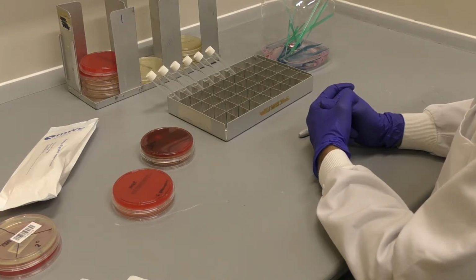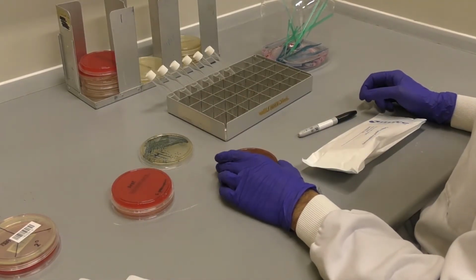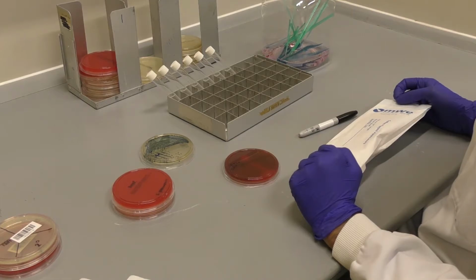The process is basically identical to that you'll undertake to set up an antibiotic resistance test. You need to label a suspension tube with the specimen number and isolate ID for each isolate to be tested, as well as one for the control strain. This will be ATCC 49619 for Streptococcus pneumoniae, or for E. coli ATCC 25922. Make sure your suspensions of test and control isolates are from fresh overnight growth on non-selective medium.